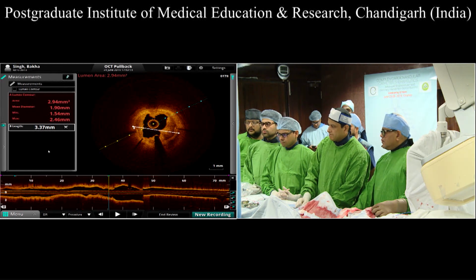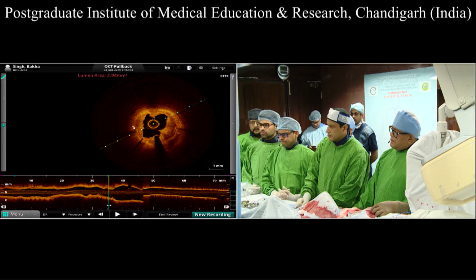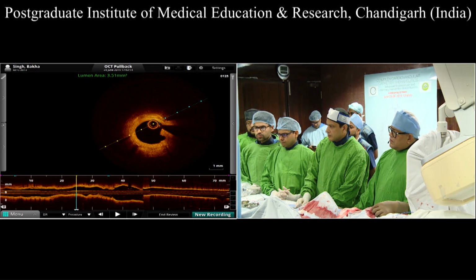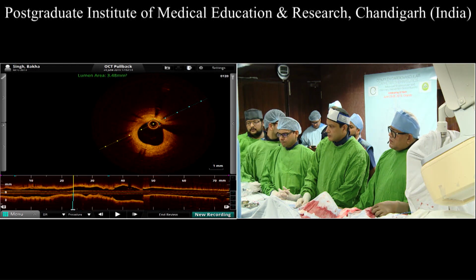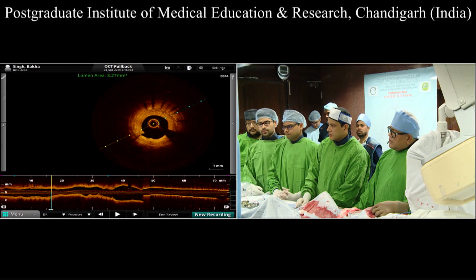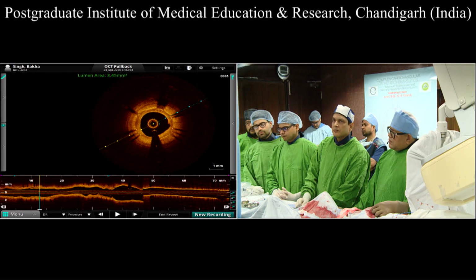So in Japan, we perform directional coronary atherectomy, aggressive atherectomy for this region, and treat with DCB. However, in India, there is no DCA. So I proposed the cutting balloon into this region and the drug-coated balloon without crossover stenting.